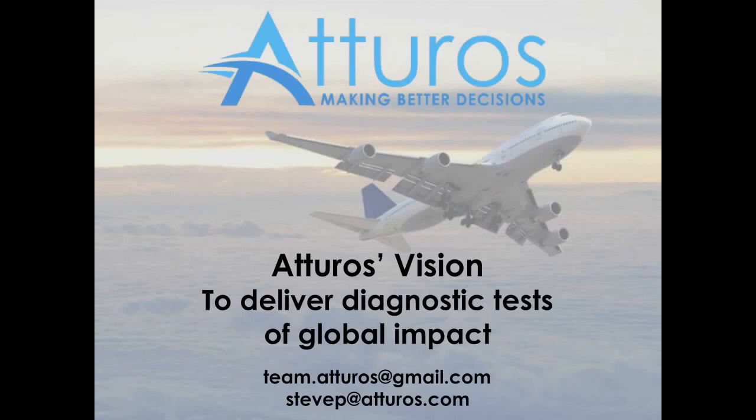Do you include isotope-labeled peptides for each peptide you're measuring? At the moment, we don't, and I think there's ongoing debate about whether this is really necessary. In many equivalent scenarios where people are measuring, for example, multiple messenger RNAs using reverse transcriptase PCR, they don't absolutely quantify each of those transcripts.